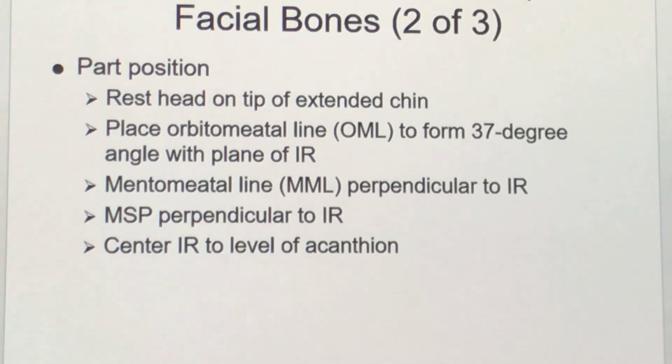And I'll point out everything that we should be able to see on the Waters here in a minute. It shows everything.